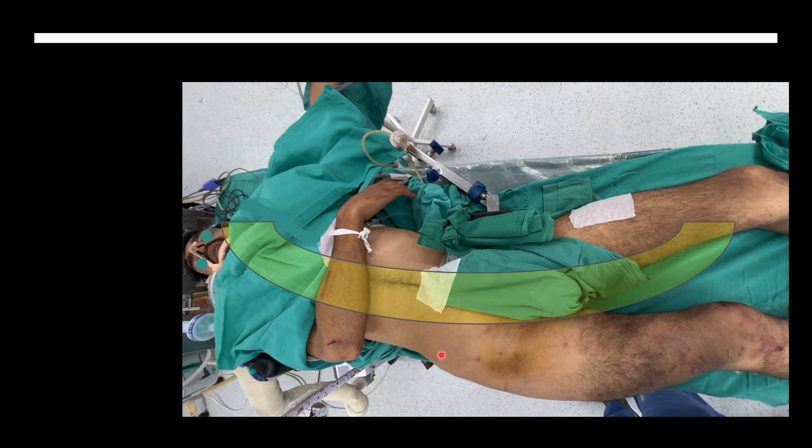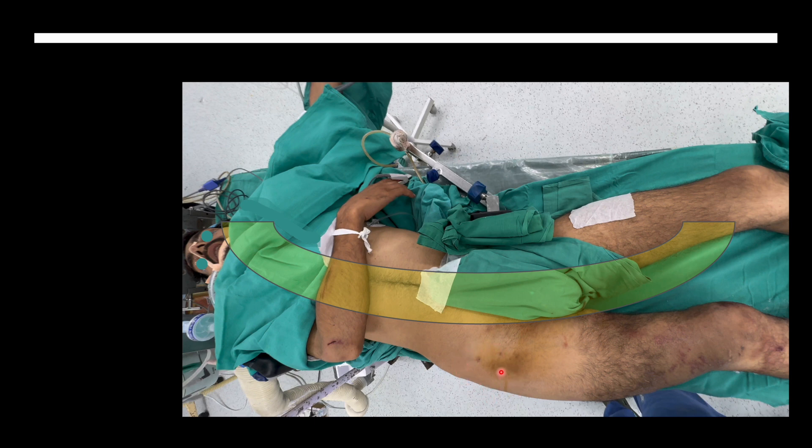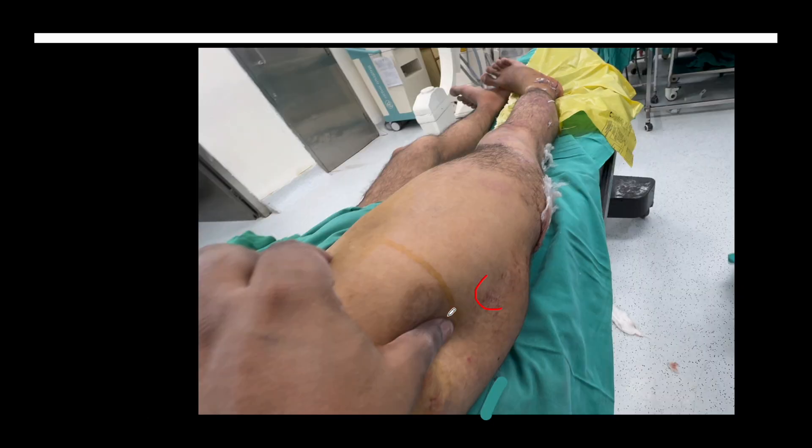You have to ensure that the trochanteric area on the affected side is perfectly clear of the table edge. The area where you are going to make your entry point — where you will place the guide wire, make the entry, ream, place the nail, and the nail jig — must be completely free with no part of the table in the way. You should be able to appreciate the dip just proximal to the trochanter. The table edge should be medial to this part.